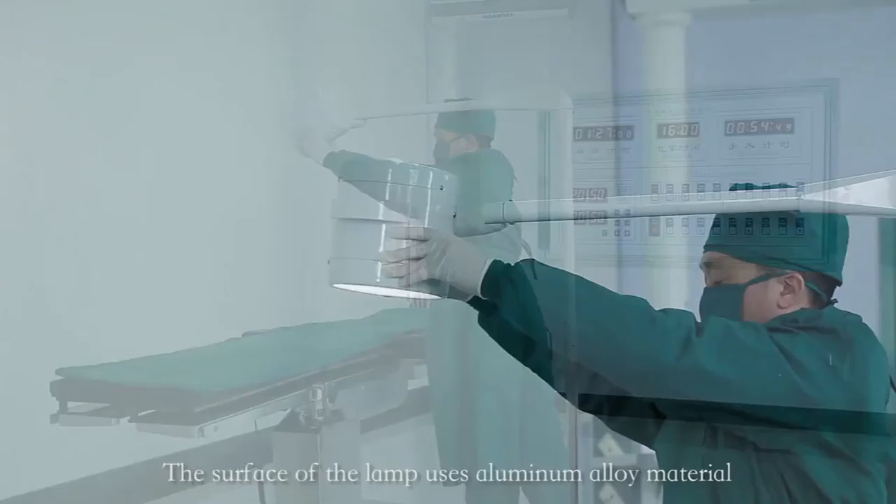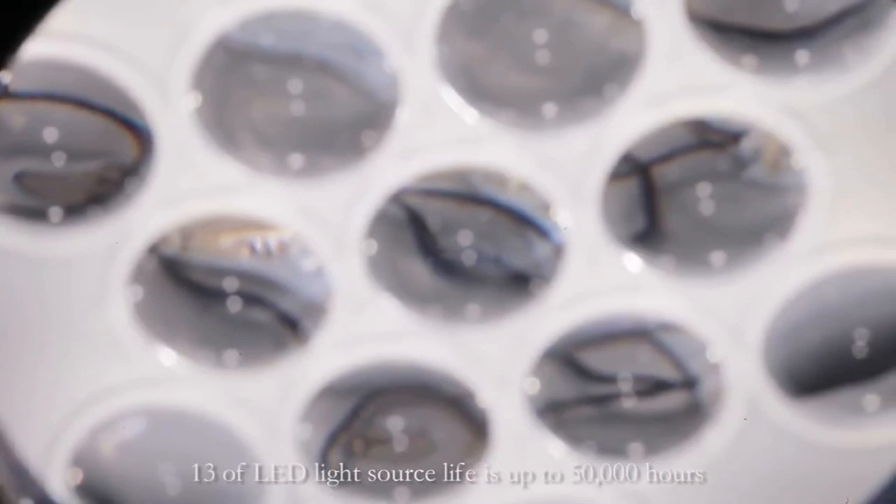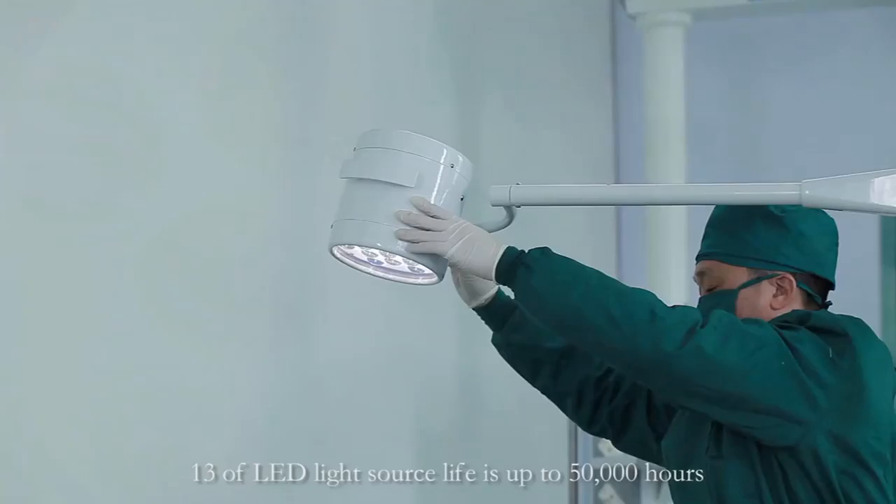The surface of the lamp uses aluminum alloy material. The lamp holder is equipped with a radiator. It's an inspection lamp that can be used long term without getting too hot. 13 LED light sources have a life of up to 50,000 hours.